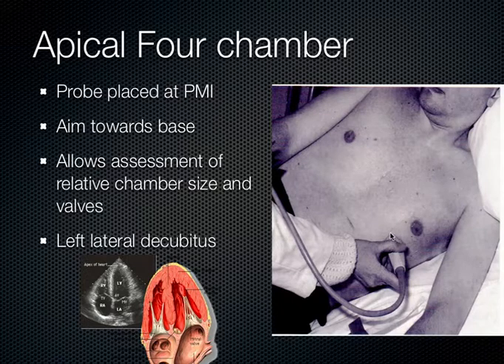Now, as this guy's laying over, I don't know if you could tell or not, but he's laying off to his side. He's on his left side. That's the position the patient really needs to be in for this apical four-chamber view. It also helps to do that for the parasternal long view as well, to tell you the truth, because that brings the heart to the chest wall a little bit better. So for either of these views, it helps to have them lay on their left side.